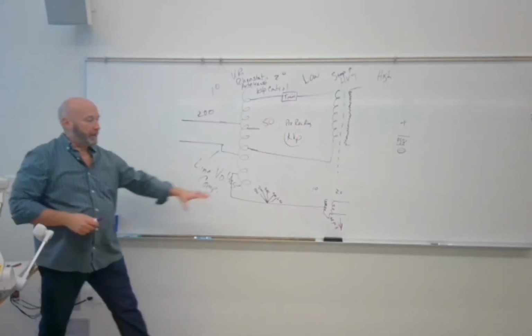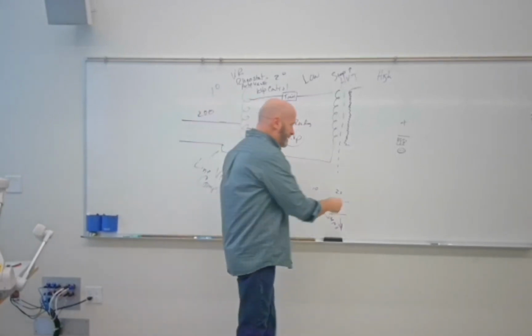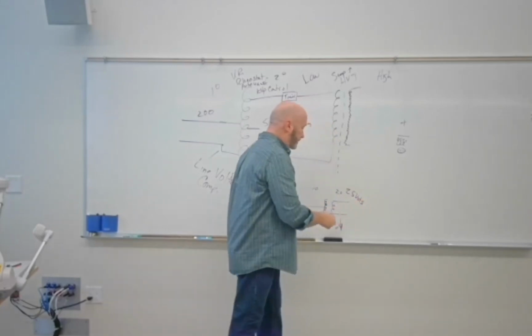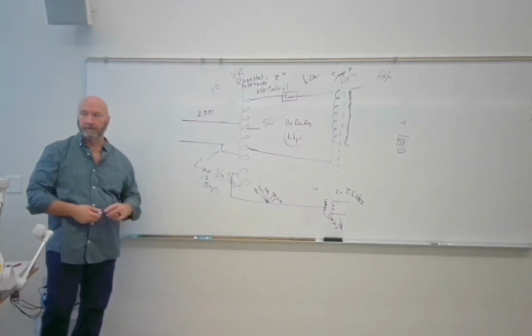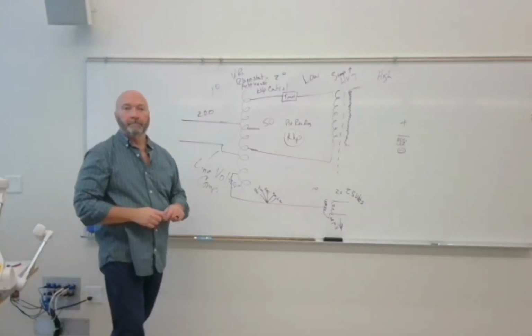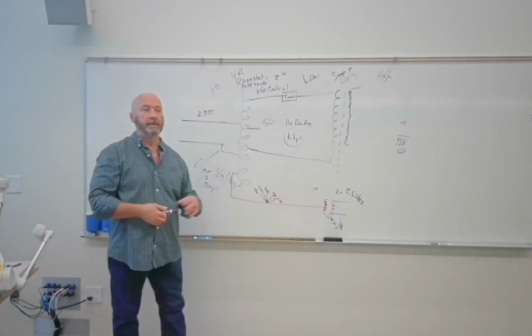So what we're going to do here is drop our voltage from that 200 volts down to something more like 25 volts. Okay, so what are volts? What do we say that our voltage does? The electron was the car and the voltage was the motor.